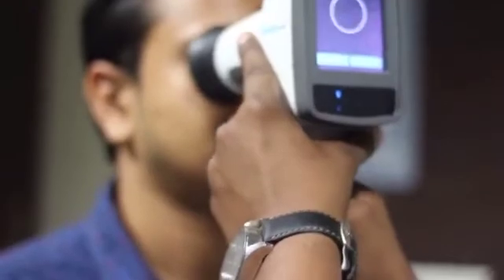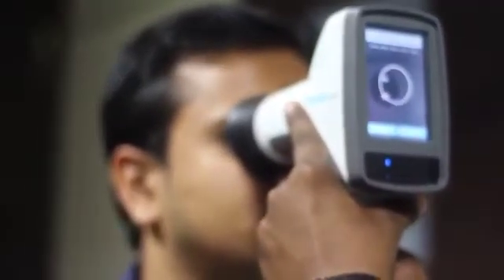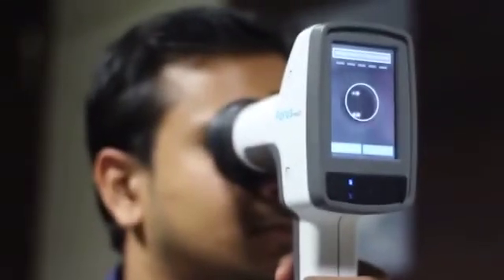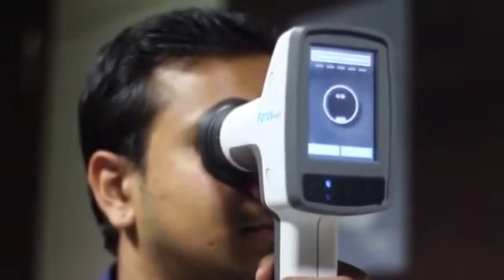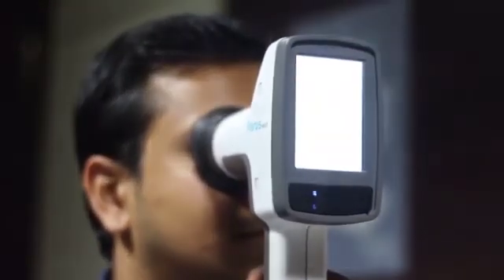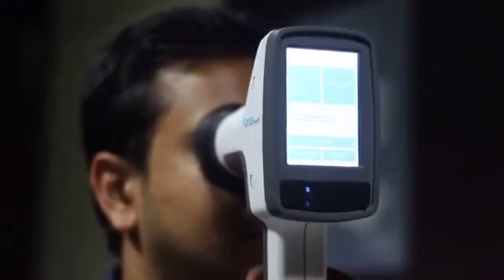Once we approach the patient's eye, we can see four dots - two top dots and two bottom dots. Aligning with those, we can capture the image. Once aligned, we can see the readings.